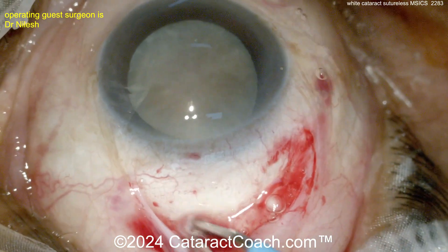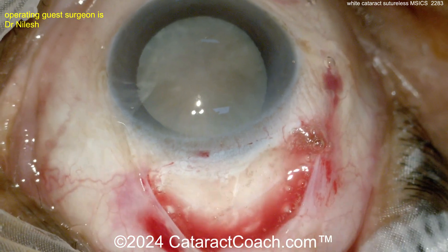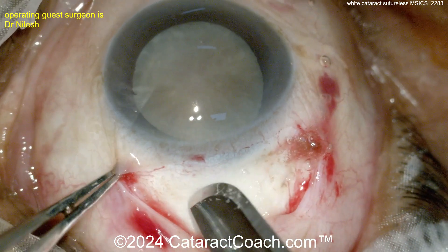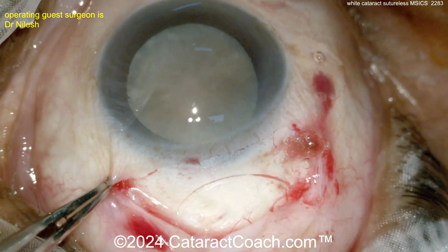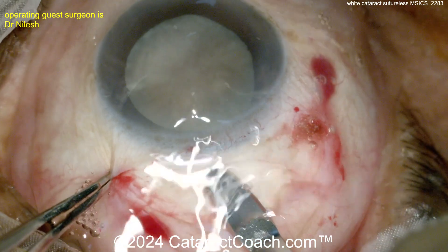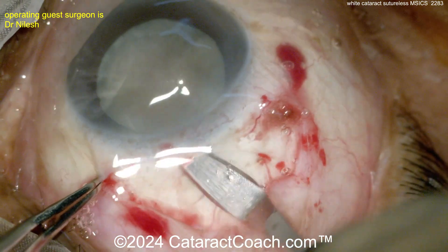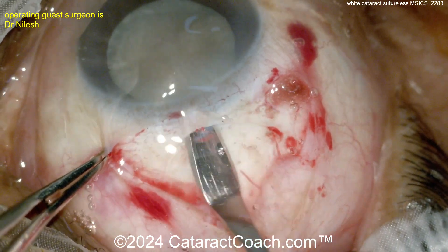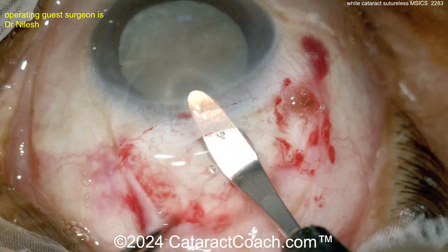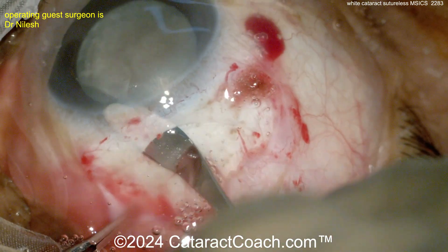The key for the whole MSICS procedure is the incision — it is so important. Now the surgeon dries up the area and creates the frown incision, which will help it seal on its own without sutures. We're now creating a half scleral depth tunnel. The key in MSICS is having a shelved incision, so notice where the blade enters the outside of the eye and then where it enters inside the anterior chamber — that's the tunnel.